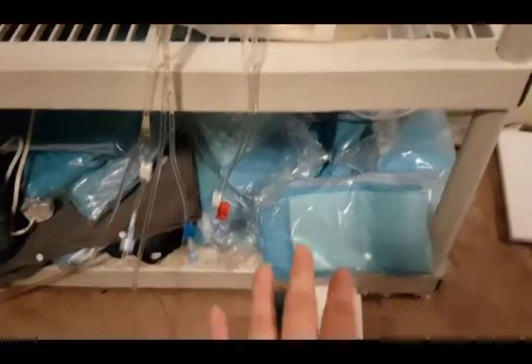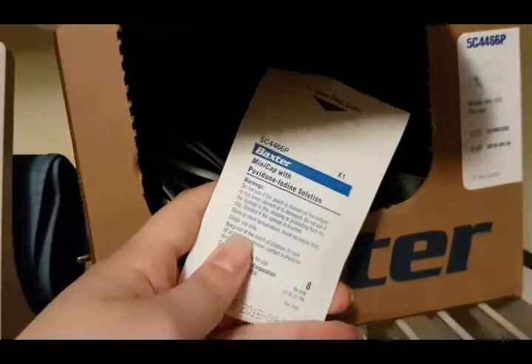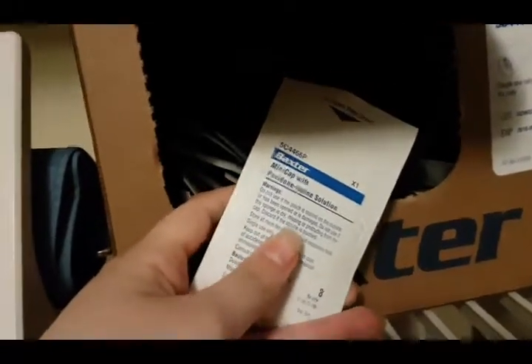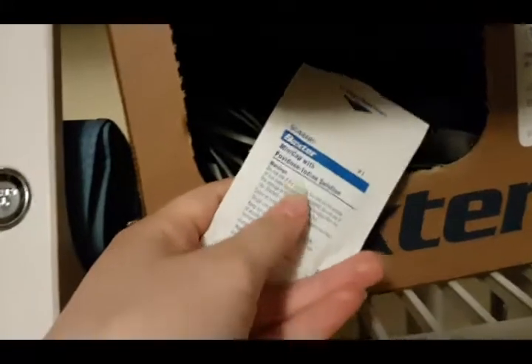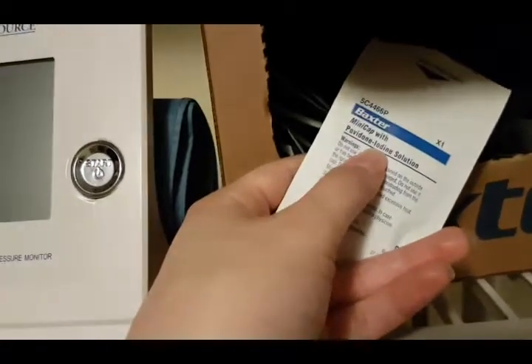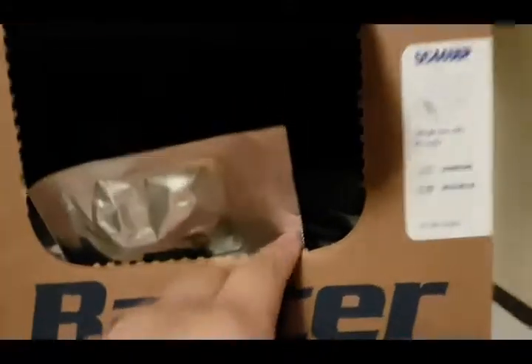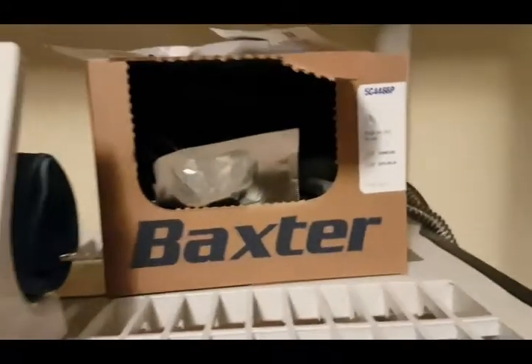And for switching and changing, we have the pads, which I can't bend down to show you because it's really hard on my dizziness. Up here we have end caps, which he has to change every time he opens and closes his catheter because he has to be completely sterile. It's called a mini cap, and it comes with povidone iodine solution, which is single use only, and it comes with an expiration date, and if it's even slightly expired, do not use it. And you'll hear all about that.